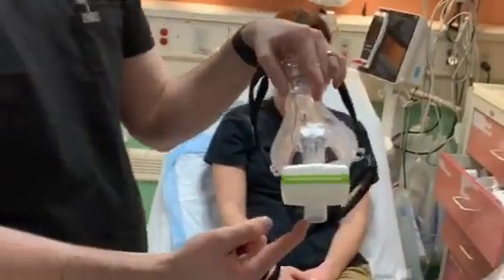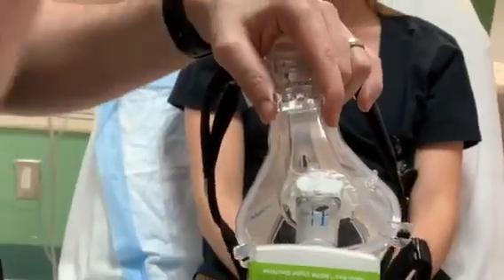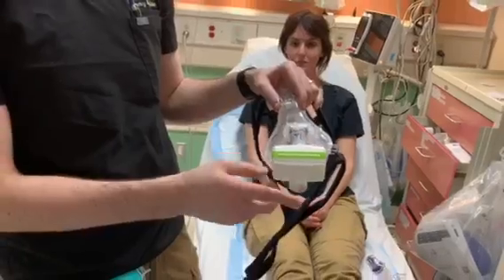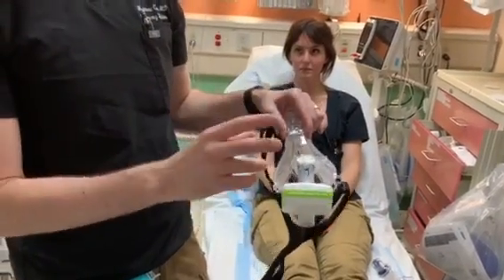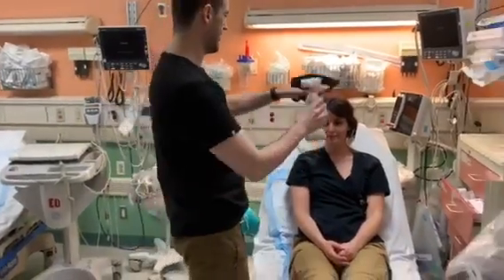The mask already has a viral filter attached to it, and this is the first thing you're going to put on. The patient will still be able to breathe, but it's going to filter all the particulates through here. It's a HEPA filter, so it filters out 99.9% of all the particles. We're going to put this on first.